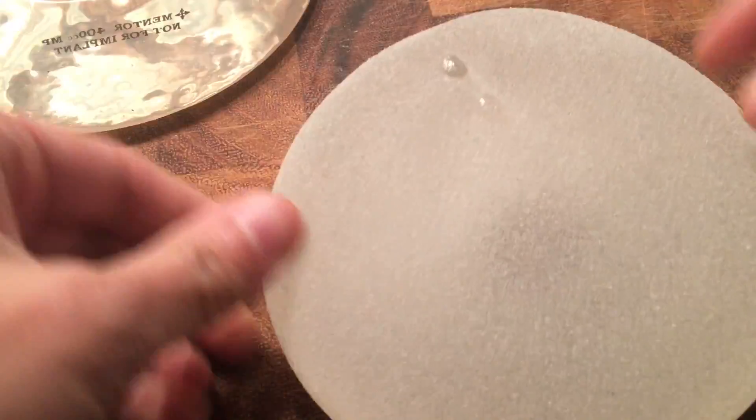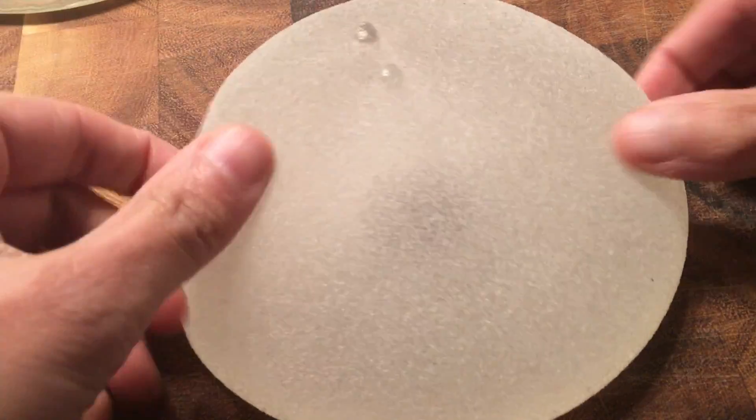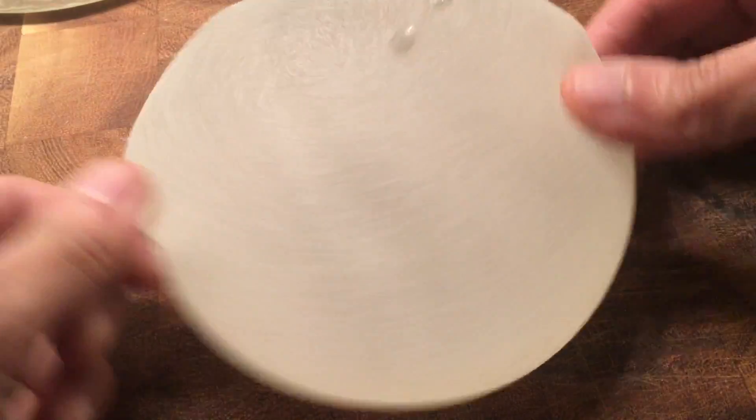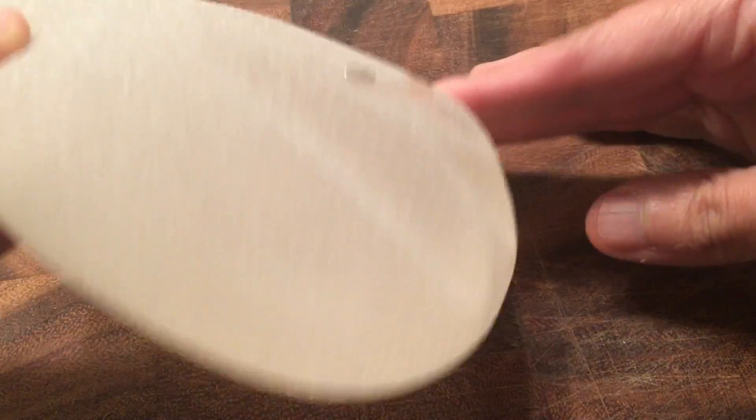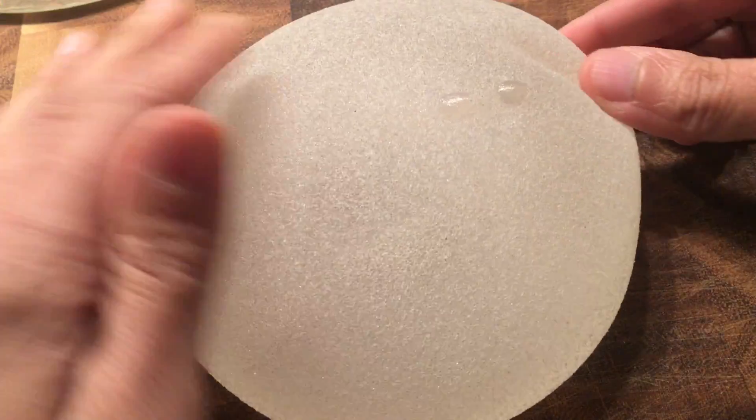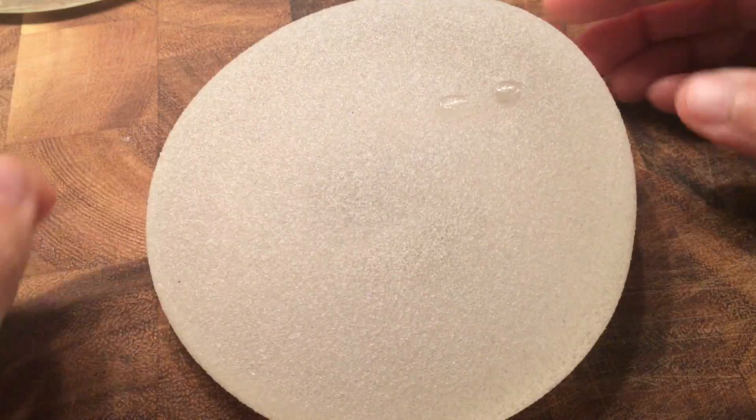The other one that we're going to look at is what we traditionally call a gummy bear implant. So if you open it up it should be fairly cohesive and this is the one that has the anatomic shape and it's cohesive. It has a cohesive gel to hold that shape.